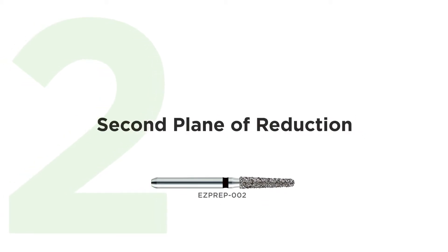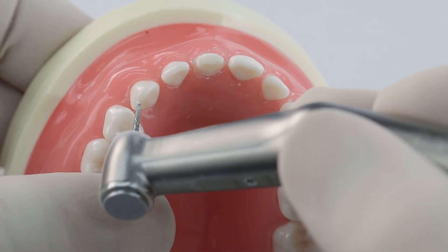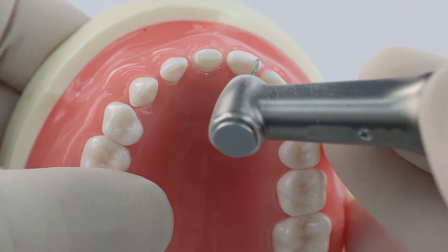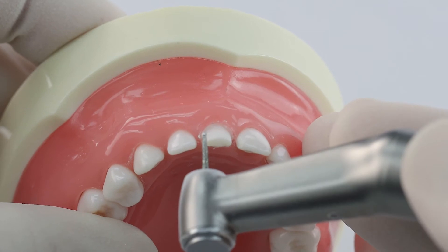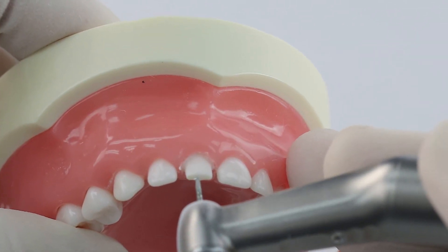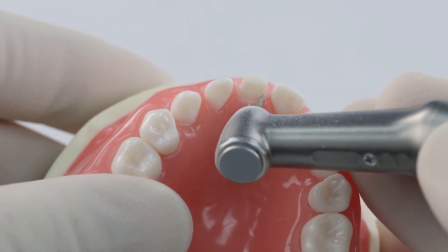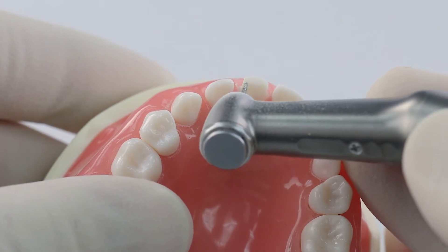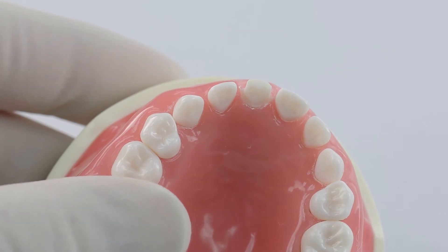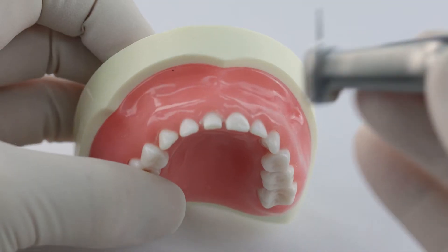Now we're going to do our second plane of reduction, and this brings me to a key point. When you're doing anterior crown preparation, you want a thin incisal edge that follows the arch form. That thin incisal edge is created by two things: number one, your second plane of reduction on the buccal from about midway on the tooth down to the incisal edge; and number two, carrying the lingual reduction up to include the incisal edge.